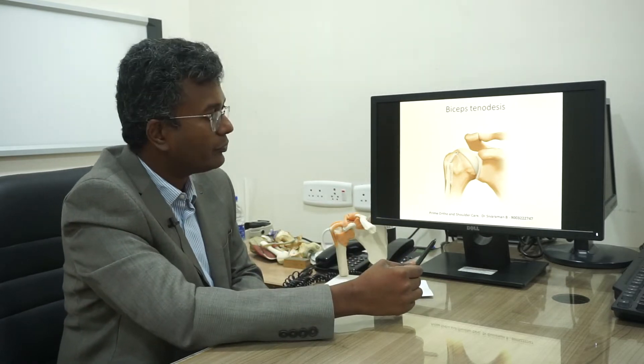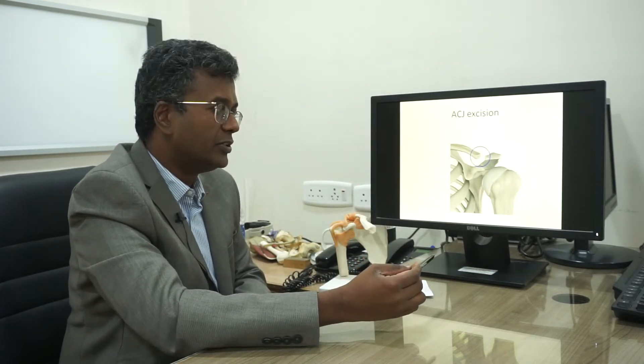Another procedure performed under keyhole surgery is acromioclavicular (AC) joint excision, usually done for patients with AC joint arthritis. Through the keyhole, we remove part of the lateral clavicle so the patient experiences less pain.